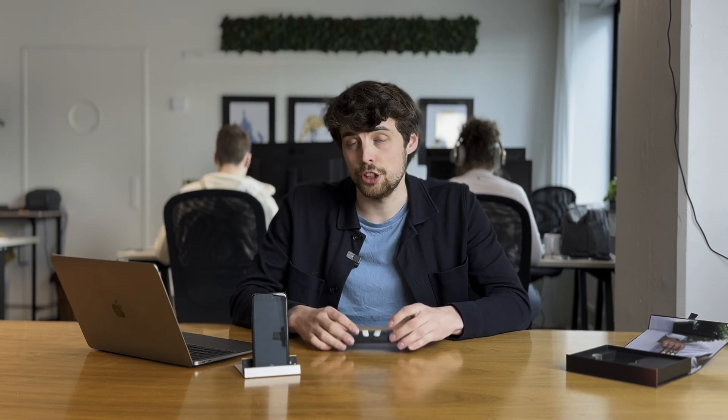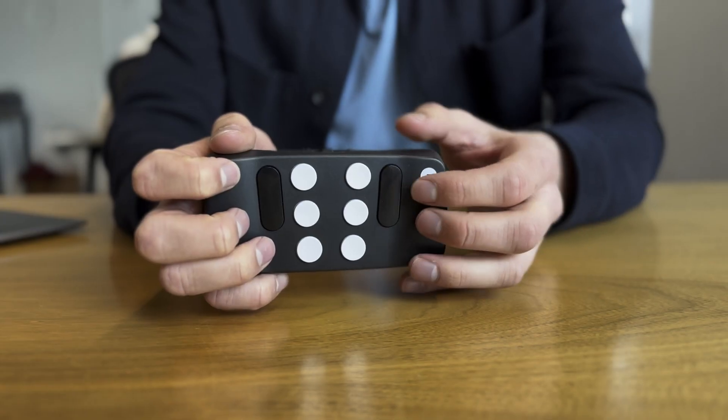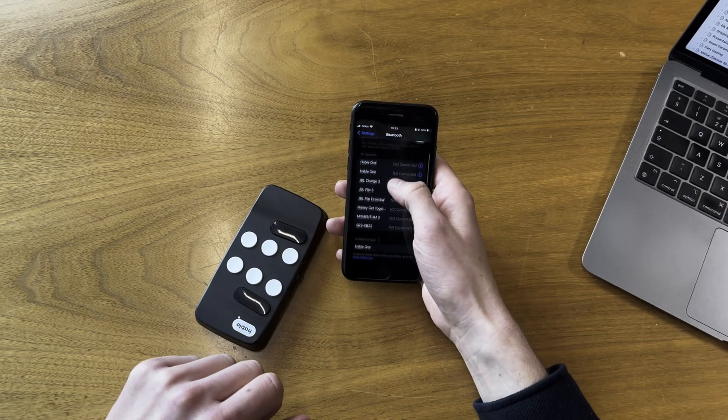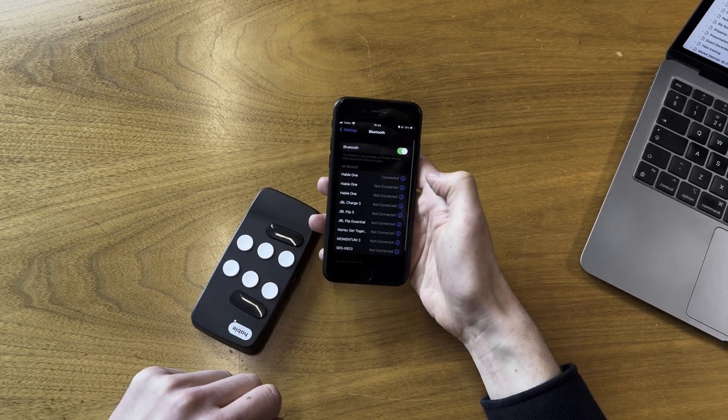The first thing we'll talk about is your setup. What do you need to get started? You'll need a Hable One connected to either your phone or your tablet. The first thing you do is connect your phone and your Hable One. Go to the Bluetooth menu — you can use Siri, go via settings, or ask someone else. With the Hable, on top you have an on and off switch. If you turn it to the right you'll feel a vibration, meaning it's turned on. When it's on, it will show up in your Bluetooth menu, and you can find Hable One and pair it from there.